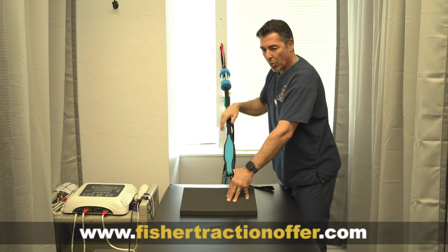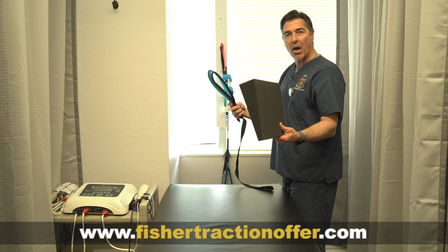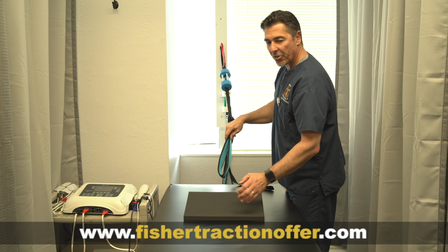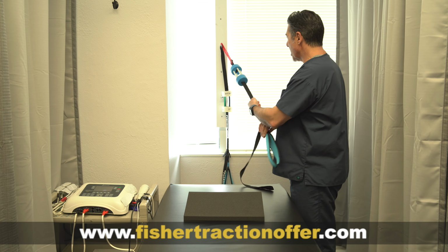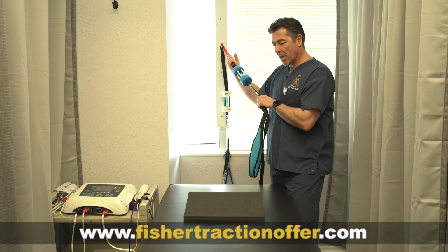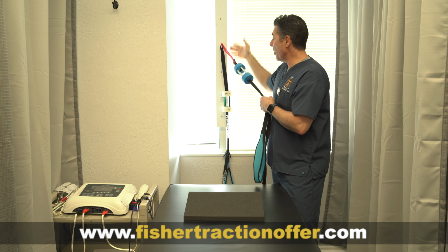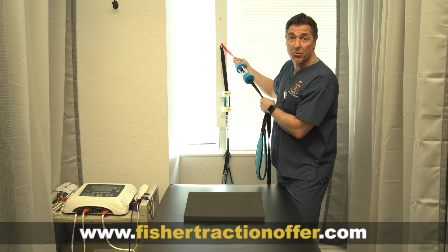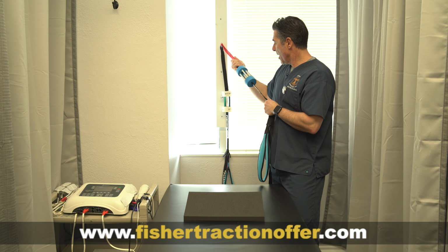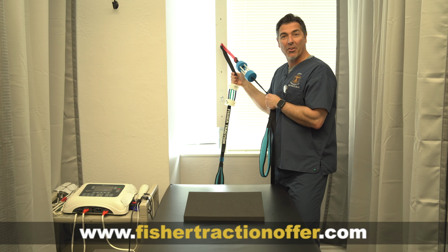We're able to have multiple stations going on. We've got our shoulder wedges. Patients know how to come in and set themselves up. You could easily have this set up in your office. If you had a gym, you could set this up on the wall and have your customers and clients lay on the ground. So it's a pretty easy way to set this up.